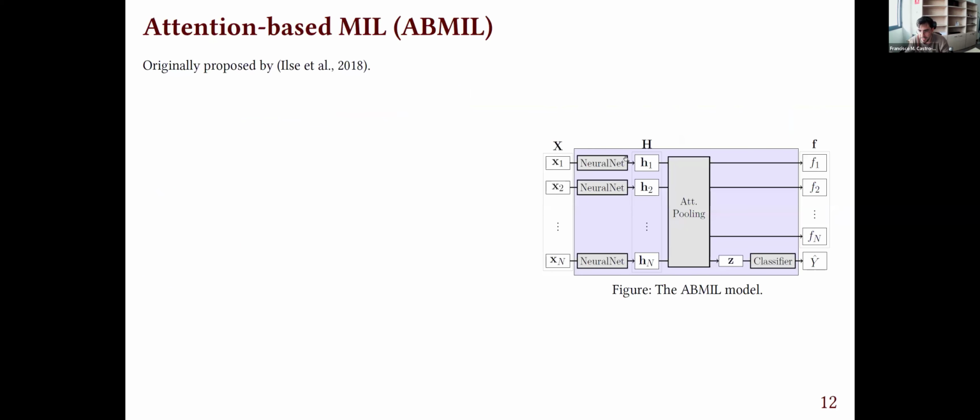The first one is this neural net here. I will talk about it in the Jupyter notebook. And this is very important, the neural network that you use here. Essentially, we're going to be using networks that have been trained using self-supervised learning. So the robustness of the decision will essentially depend on this network, if it allows to obtain a meaningful representation.